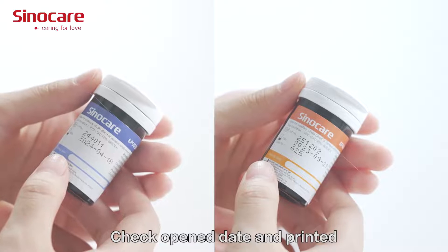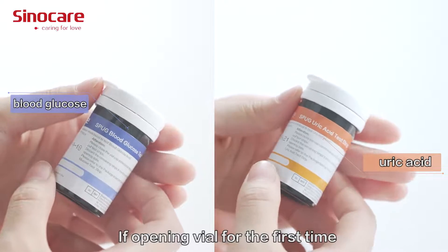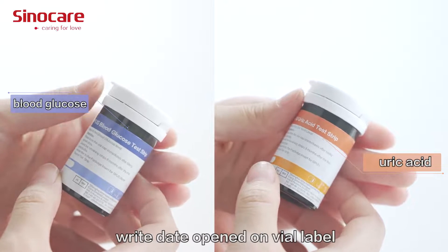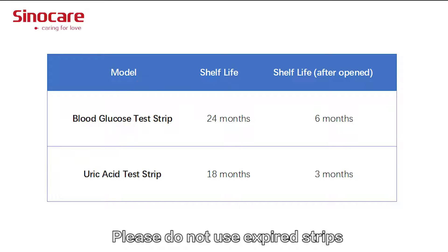Check and note the expiry date printed on the test strip vial label. If opening the vial for the first time, write the date opened on the vial label. The shelf life details are shown on the screen. Please do not use expired test strips.